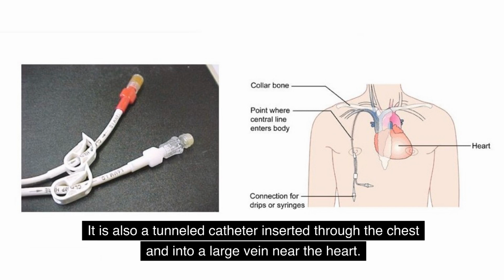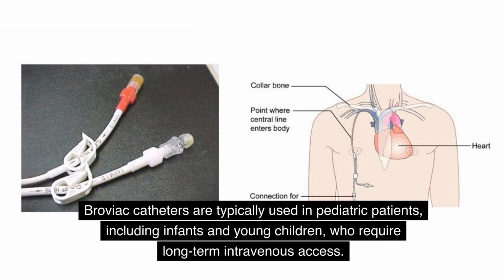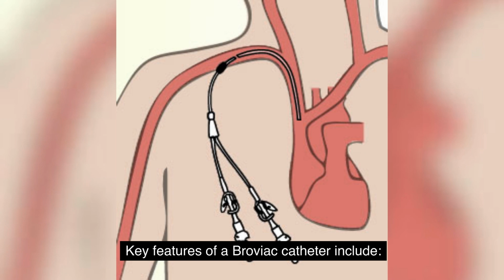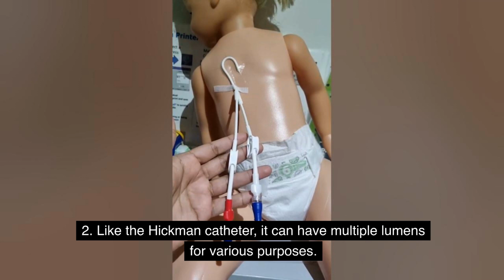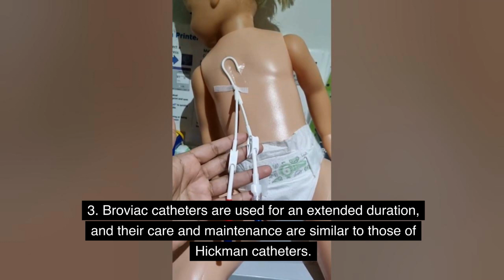It is also a tunneled catheter inserted through the chest and into a large vein near the heart. Broviac catheters are typically used in pediatric patients, including infants and young children, who require long-term intravenous access. Key features of a Broviac catheter include: 1. It is designed with a smaller diameter to accommodate the needs of pediatric patients. 2. Like the Hickman catheter, it can have multiple lumens for various purposes. 3. Broviac catheters are used for an extended duration, and their care and maintenance are similar to those of Hickman catheters.